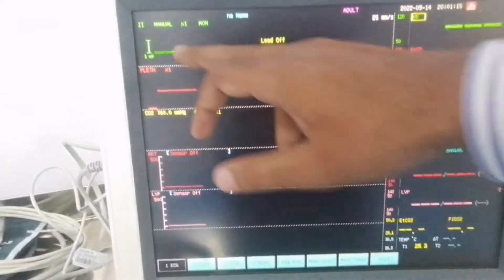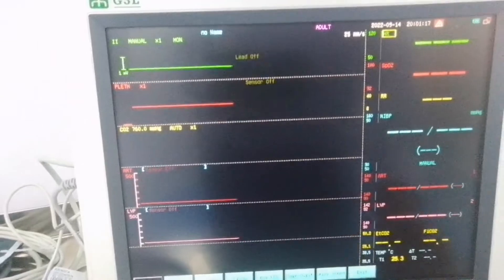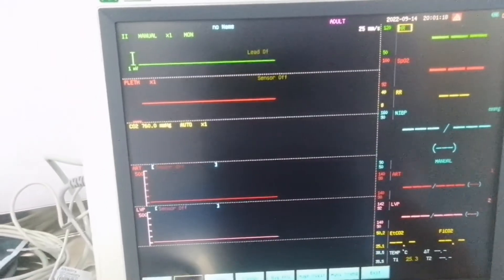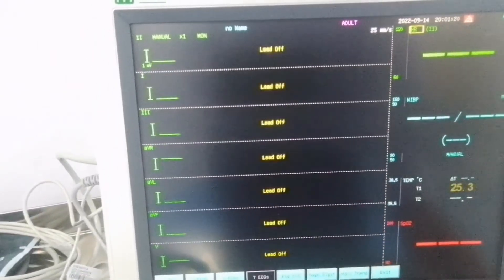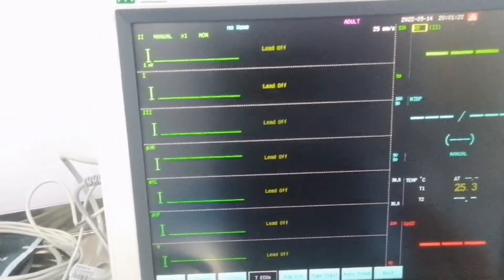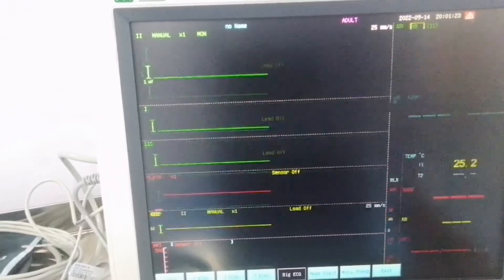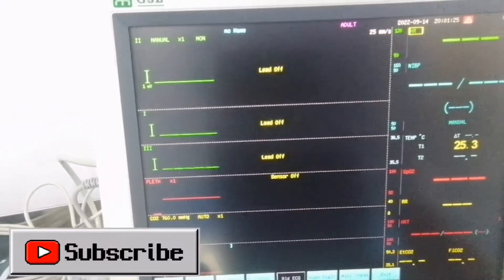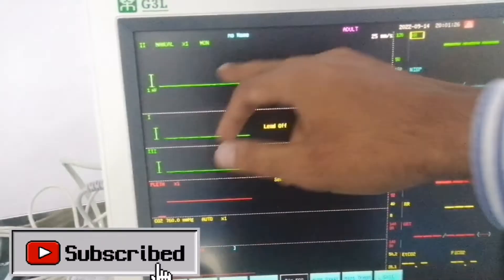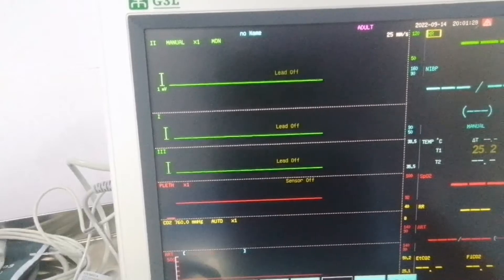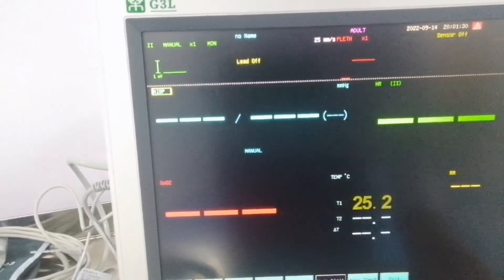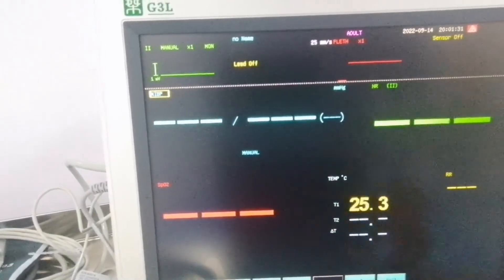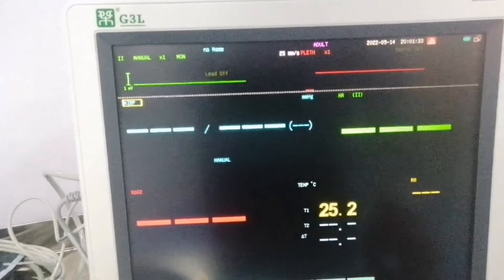So the 1 waveform is on the main screen. If I go to 7 ECG, the 7 ECG is on the main screen. Same if I press big ECG. So one waveform is big and the other ones will be small.